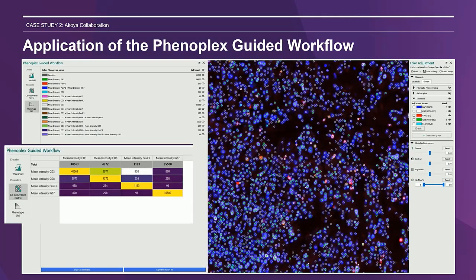Once we have set thresholds for each marker of interest, we can begin to QC and confirm the results on the module. Using the co-occurrence matrix, we can look for co-expression of expected markers and look for mutually exclusive markers to ensure we don't have a high frequency of co-expression of these in any of the detected objects. Using the interactive visuals from this, we can easily go back and adjust thresholds where required. We can then visualize all phenotypes generated in the module and view these in combination with each other. As we required visualization of these labels on the image overlays, we took the thresholds defined in the module and incorporated them into the app author to phenotype all objects.